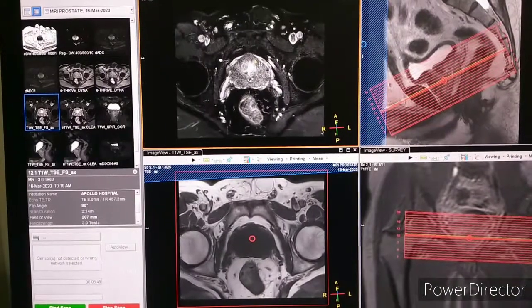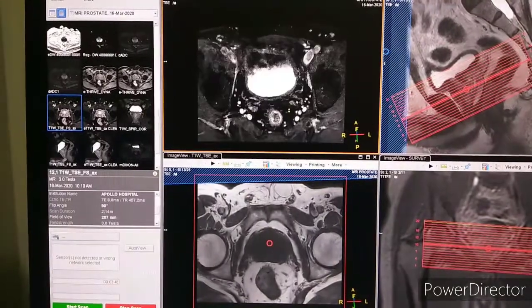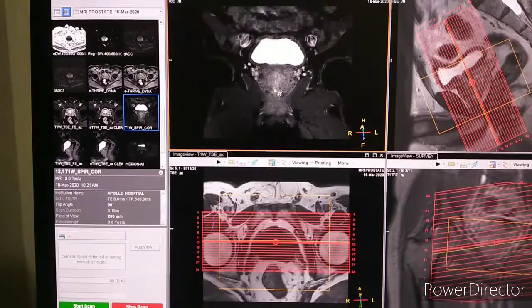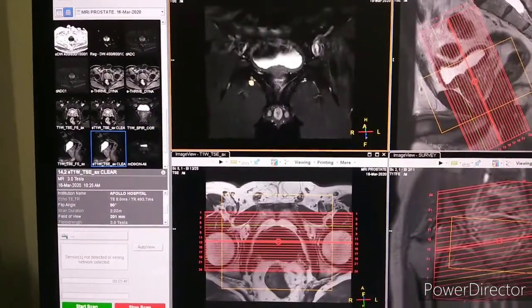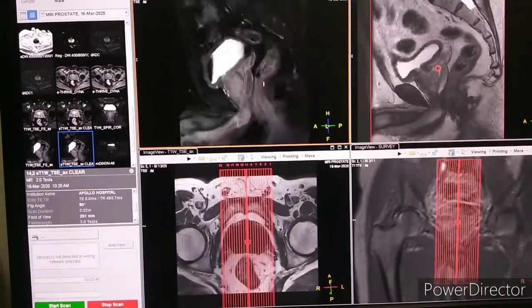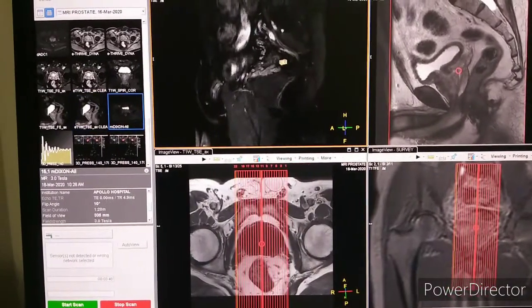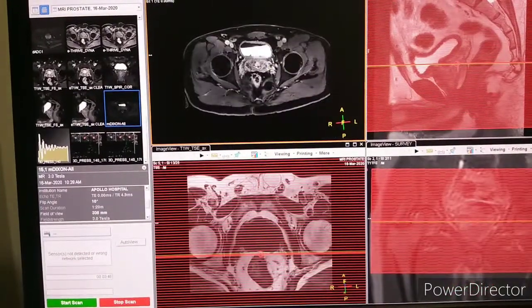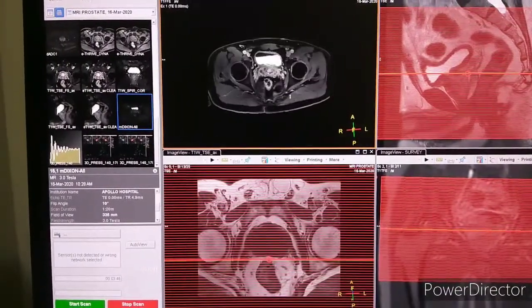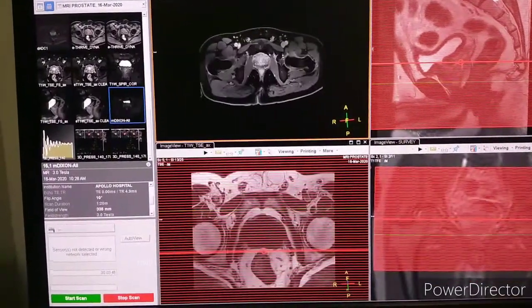Post-contrast fat-suppressed T1 weighted imaging is acquired in all three planes: axial, coronal, and sagittal. There is also an additional sequence for the full pelvis region to see lymph nodes — in case any lymph nodes are present, we can cover them.